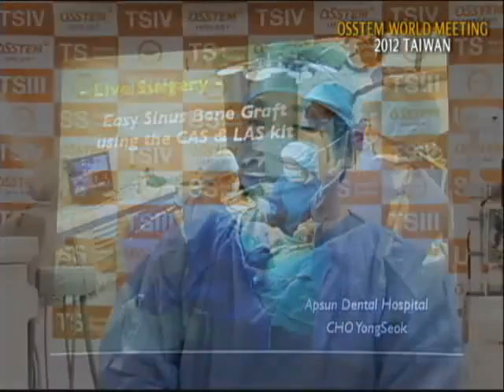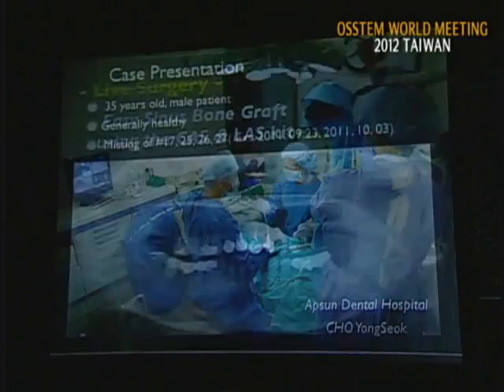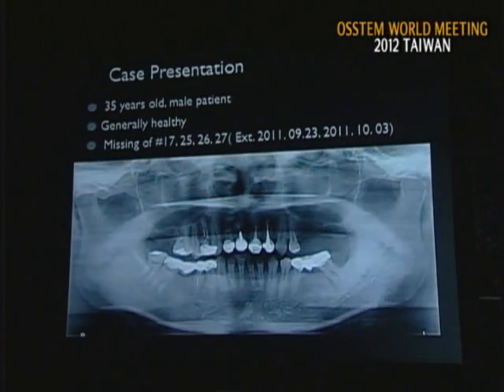I'm very happy to show you the live surgery. Today, I want to show you a very nice instrument, which is the sinus graft kit. Let me introduce the live surgery case. The topic of the live surgery is sinus bone graft using the CAS and LAS-Kit.